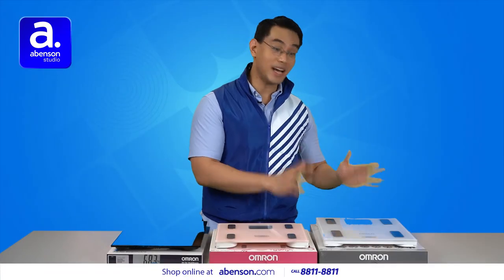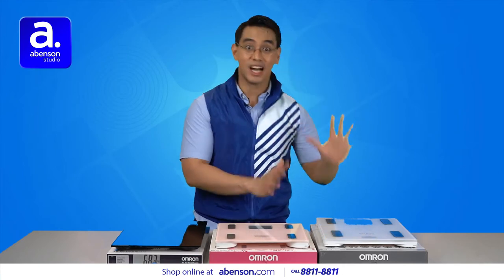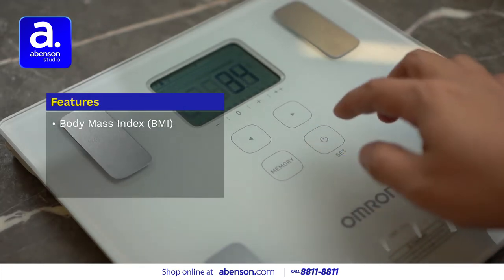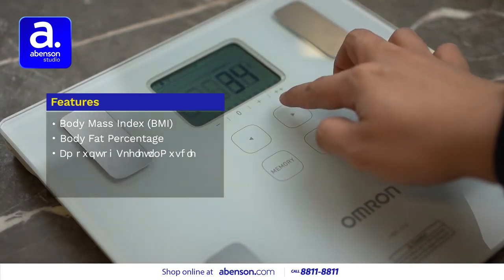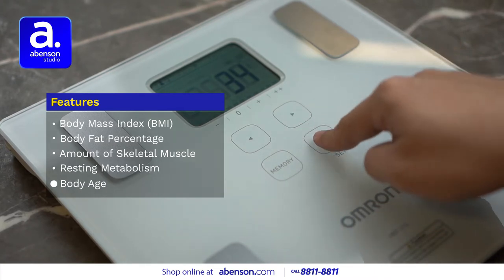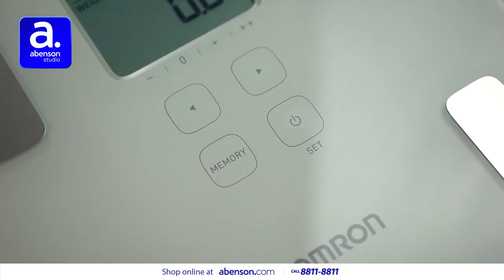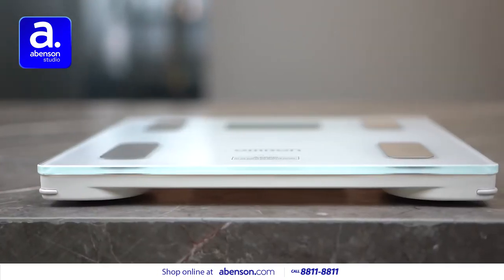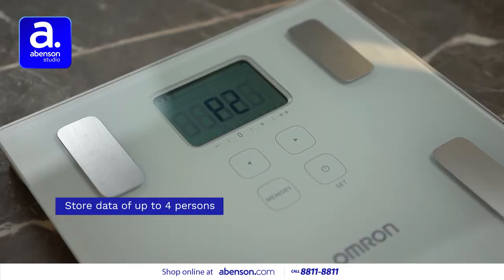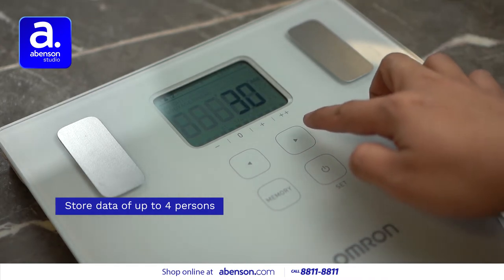Next up, we have the body composition monitor, HBF214, which has a ton of features. Aside from giving you your weight, it can display your body mass index or BMI, body fat percentage, the amount of your skeletal muscle, your resting metabolism, and your body age. So if you're planning to constantly track those measurements, this body composition monitor will be a very useful tool. It can also store the data for up to four persons, so you can share it with the rest of your household.